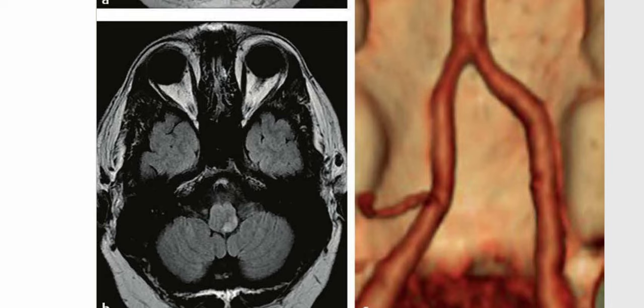And on this CT angiography image, this is the three-dimensional volume rendered image from the CT angiography, and it shows that there is absence of the left PICA, while a portion of the proximal right PICA is visualized here on the contralateral side. However, there is absence of left PICA. Although visualization of PICA on CT angiogram is variable, this occlusion was confirmed on the conventional angiogram as well.